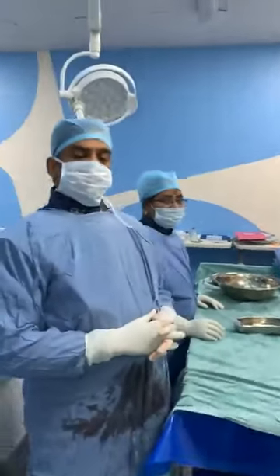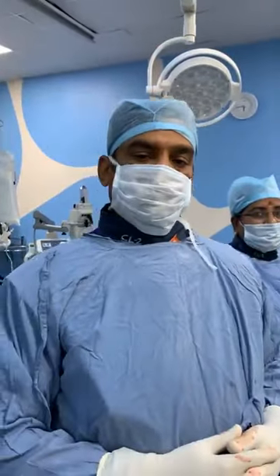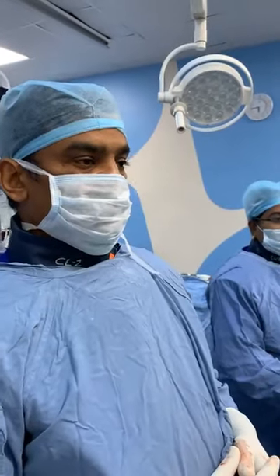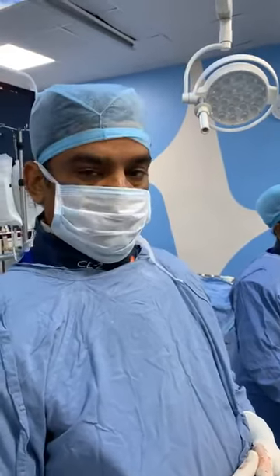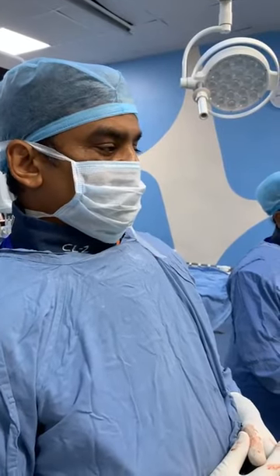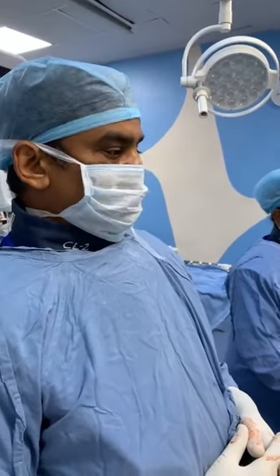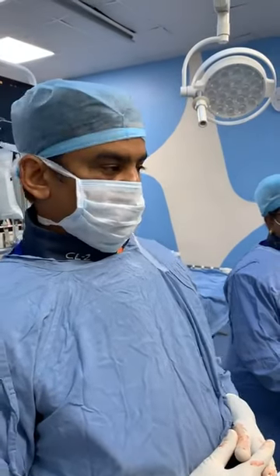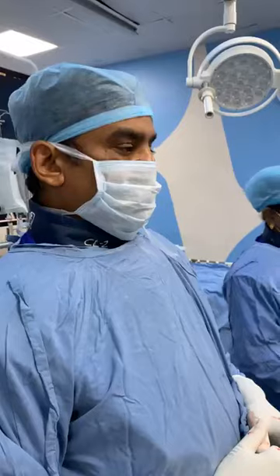So there can be various concepts. Some people think that when you put a stent and you want to put a flow diverter inside it, especially if it is a laser cut stent, some people prefer to do a balloon angioplasty. But here, because this is a 2015 stent, I would assume that it has been endothelialized, and I don't have to really do a balloon angioplasty.